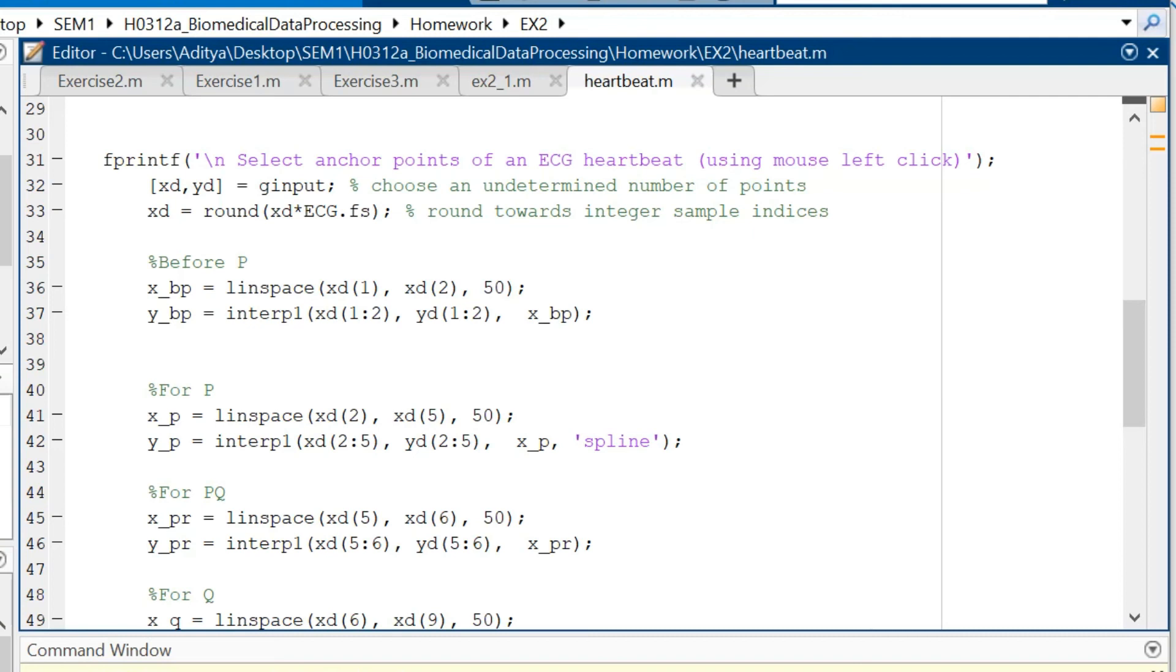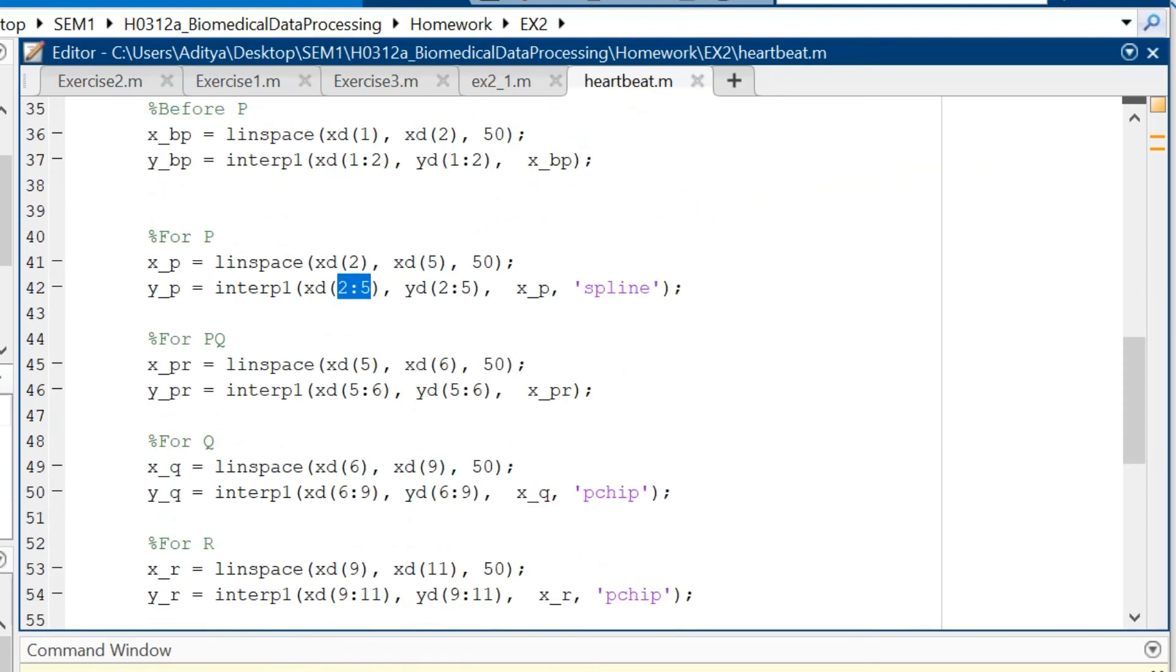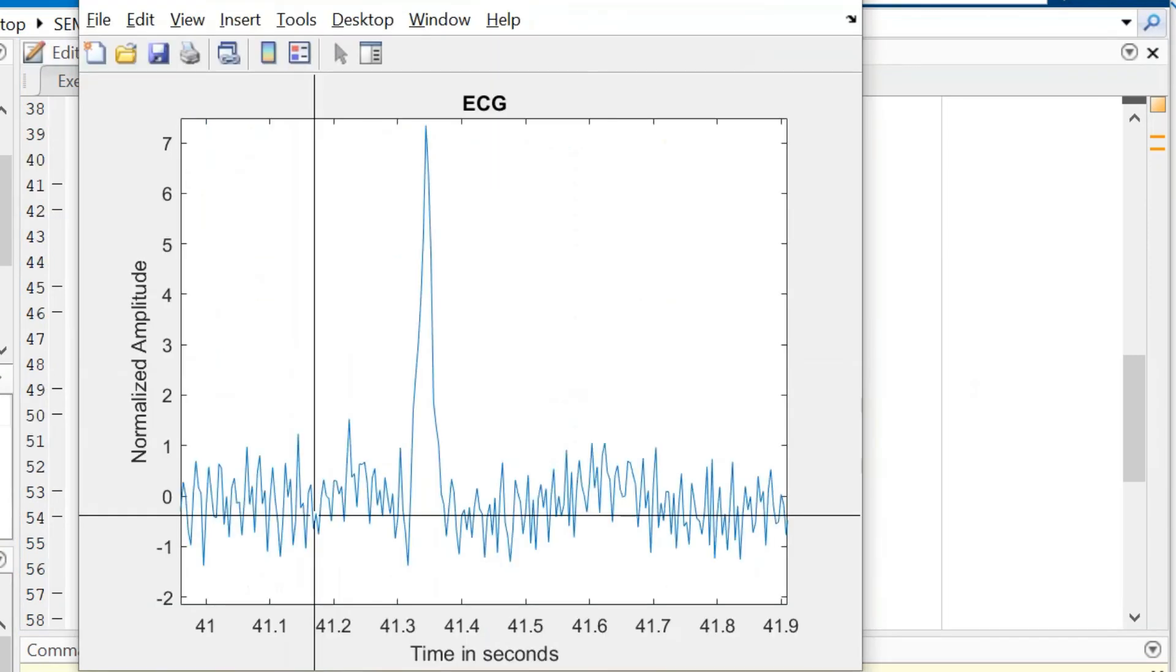Then for the P segment I am selecting 2 to 5 which counts for an entirety of 3 points. For PQ again just a single point.